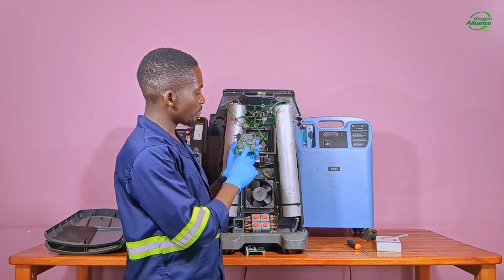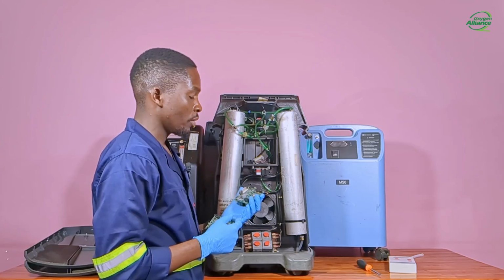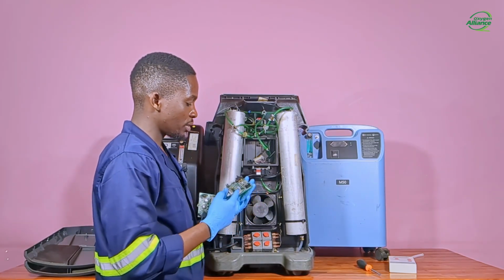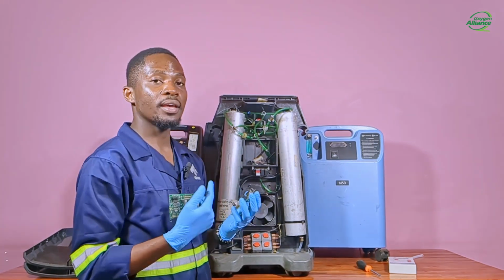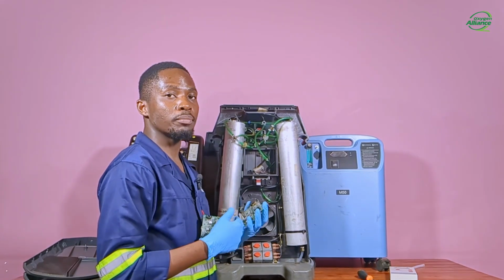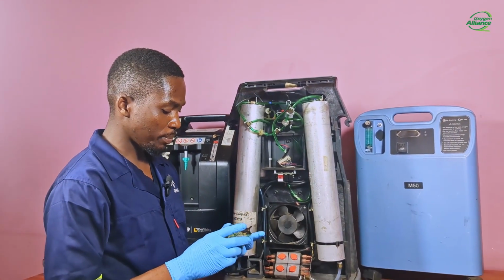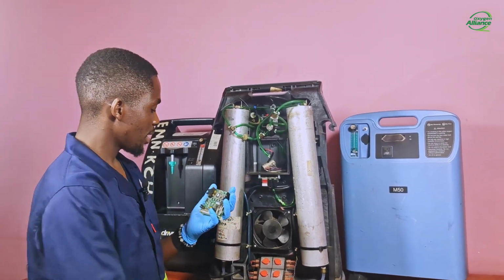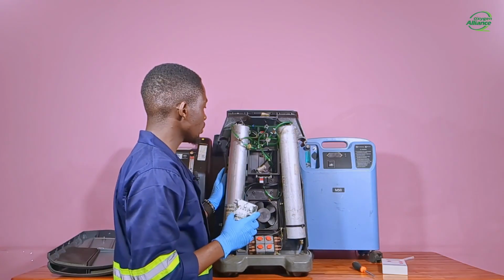So you have the varistor, these two resistors, and this capacitor. We have already made a video on how to troubleshoot this problem to do with power supply, and you can find a link in the video description below. Now I will replace this faulty board with this other board and then observe if that improves the oxygen purity of this oxygen concentrator.